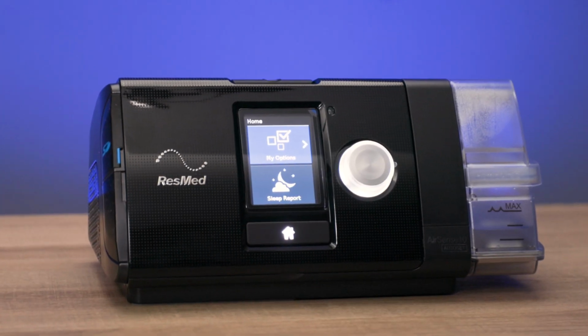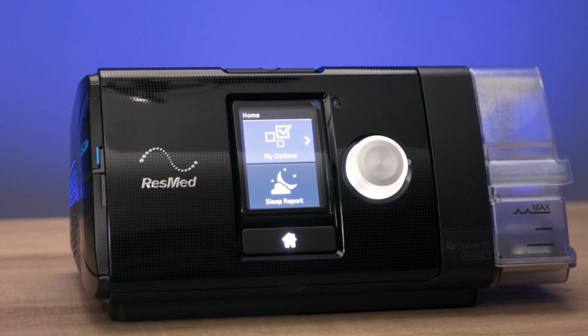But note that this process is physical and local. You can view your data on your device and you can remove the card with your data on it, but you can't provide remote access to your data without first uploading it to the cloud using an internet-enabled device like a home computer. And you can't provide remote access directly to your device at all.